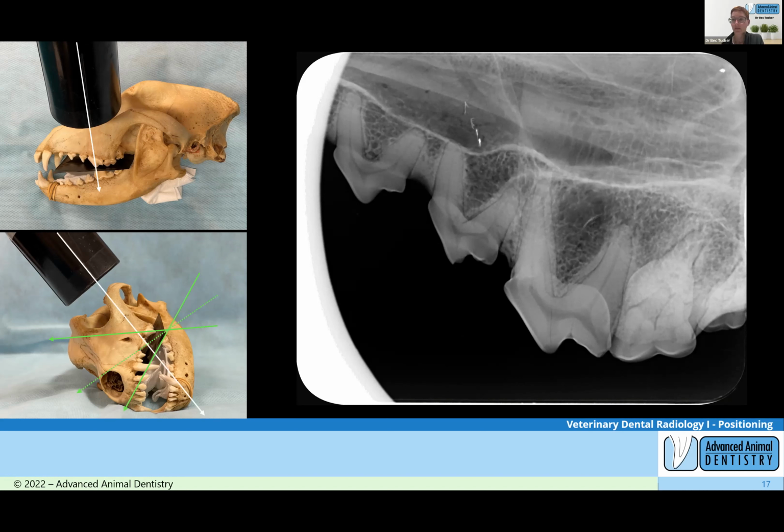To bring in some of what Karen asked about brachycephalics, when we talk about the SLOB rule, if people are familiar with it, it's about rotating not just in the vertical plane but around your patient's head as well. If I've got a brachycephalic with some rotated teeth and I want to focus on that tooth, I'll use the smaller plate and keep my vertical angle the same, but rotate around in a horizontal plane. So my generator is coming face on to that tooth, which often reveals the anatomy of that tooth quite nicely, but you'll probably get distortion of the teeth around. So in brachys, we're often taking more images of individual teeth rather than trying to do a survey shot to get a lot in one image.